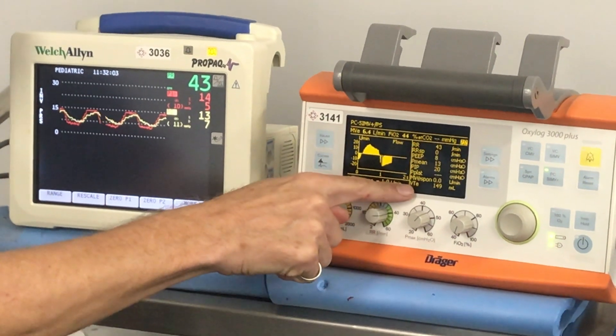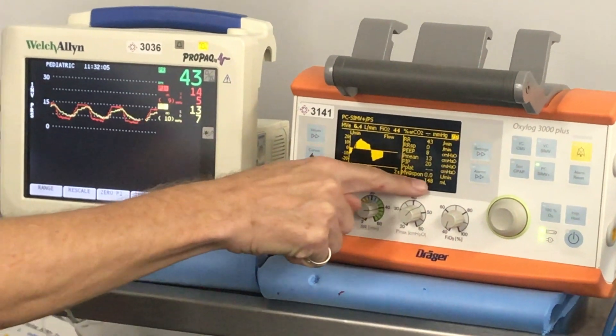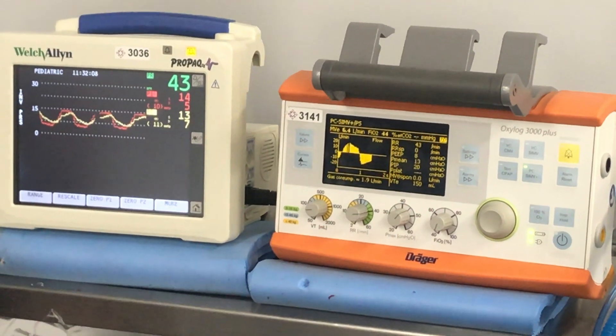The most important value to look at is your tidal volume, because that's the one where you'll see changes if anything you're doing is going to help.